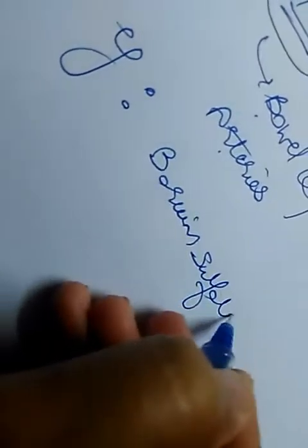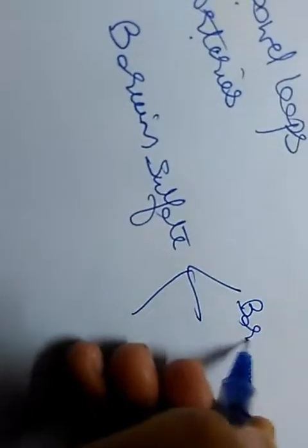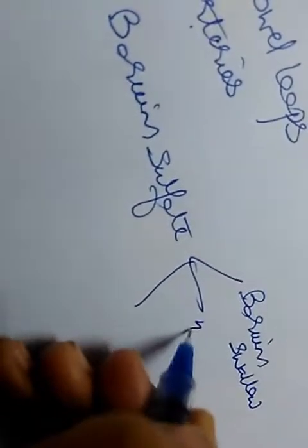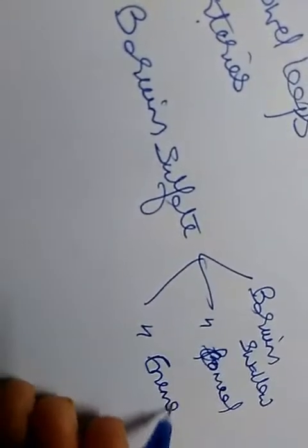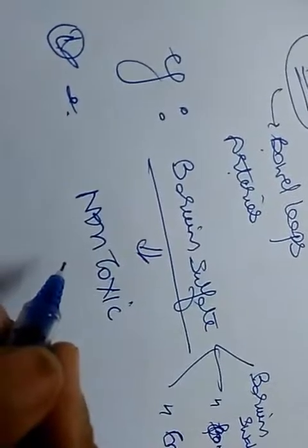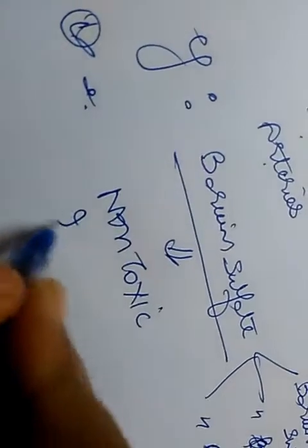We can give it in three ways: barium swallow, barium meal, and barium enema. So why do we use barium sulfate? First of all, because barium sulfate is non-toxic, and it is an insoluble salt.